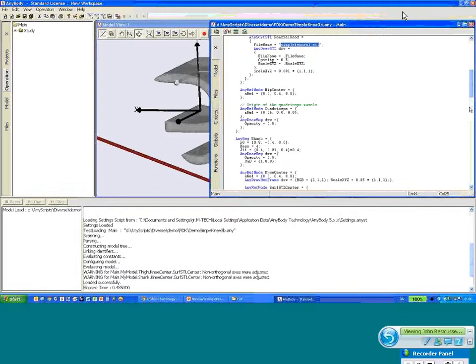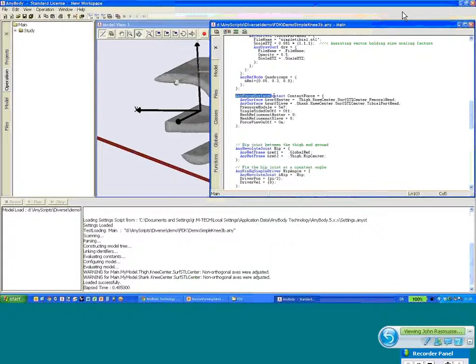As we go a little bit further down, you can see that there is now an any force surface contact object defined here. And this object is defining one surface which is called the master surface, which is this one, and this is the femoral head. And then there's one surface which is called the slave surface, which in this case is the tibial part. Now, what the system does when we have a couple of surfaces like that is that the system is detecting contact between these two parts, and to the extent that they are penetrating each other, it is going to generate contact forces between the two surfaces, and those contact forces are going to depend linearly on the penetrated volume, and the coefficient of elasticity for that computation is the one that you see here. So this is the way to make the materials for the two components more or less hard.